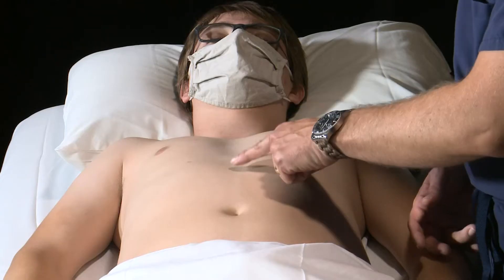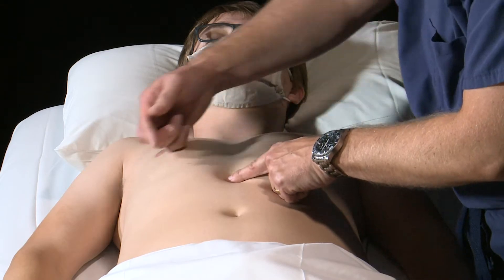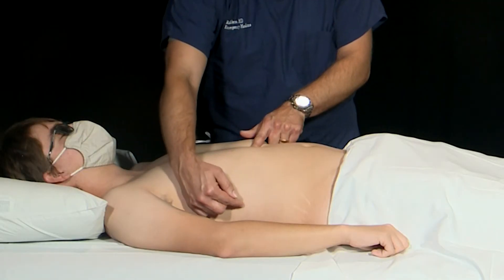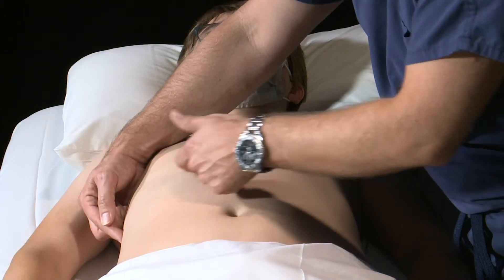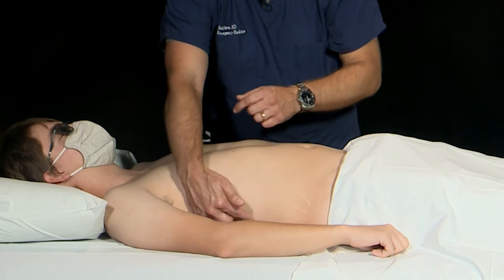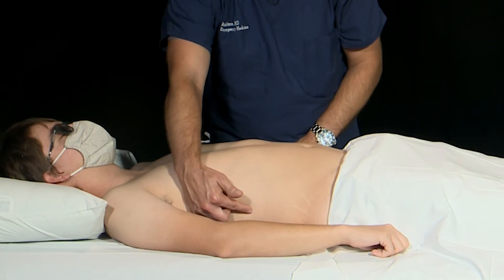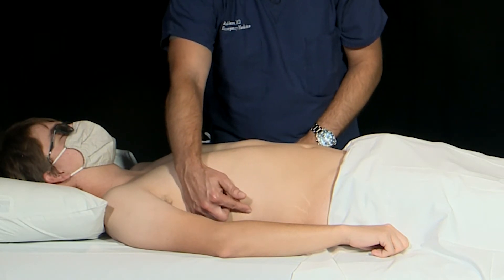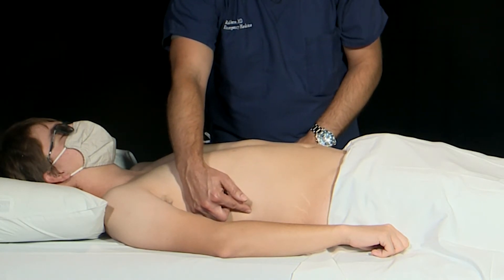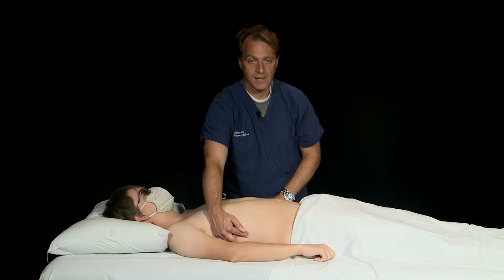To find the right upper quadrant view, we're going to draw an imaginary line from the xiphoid process all the way to the mid-axillary line. Where these two lines meet is where the probe placement will begin. The probe is going to be held in a coronal plane with the marker dot pointed towards the head.